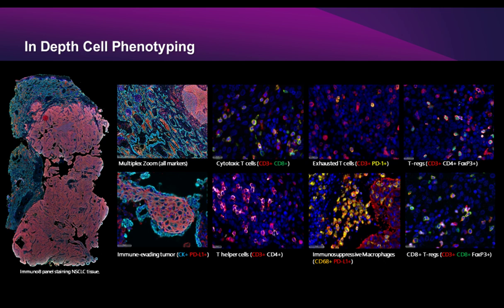Let's continue. Can the Ultimapper assay be used on fresh sections that have not been embedded in paraffin? We don't test that internally formally, but we have some customers that are evaluating that right now as we speak. It speaks to the same point that Scott had just made. They will require some fixation processing, and working that out and optimizing that is what would be required to see if our assay would work optimally there or not.